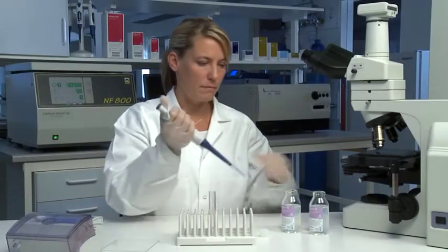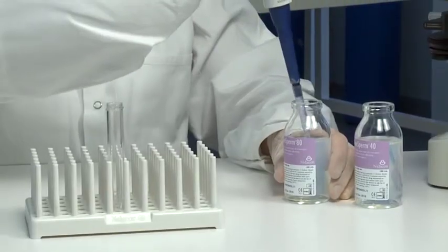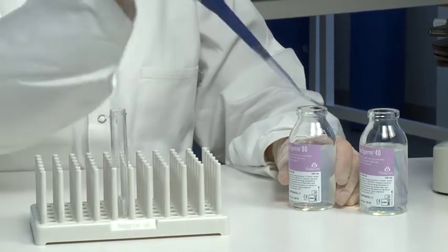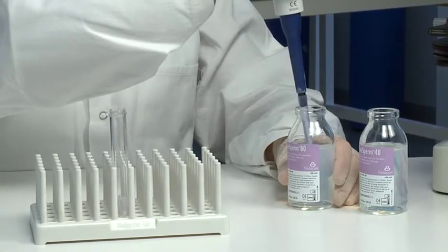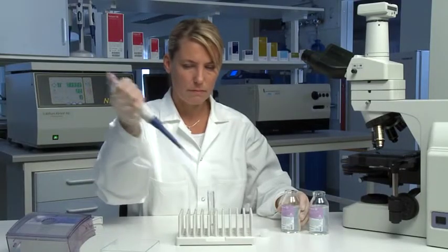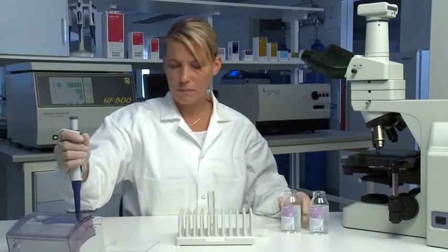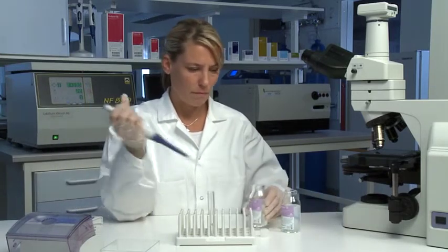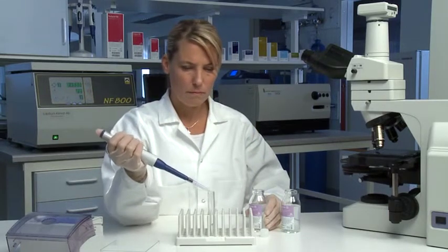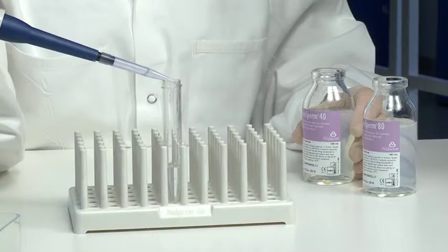Pipette 2ml of PureSperm 80 into a sterile conical centrifuge tube. Carefully layer 2ml of PureSperm 40 on top of PureSperm 80. Make sure not to disrupt the layers, creating a sharp interface between them.